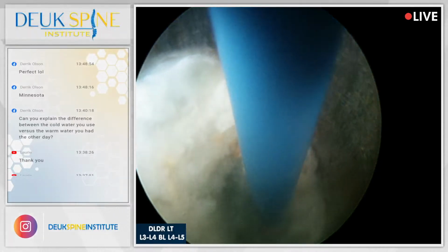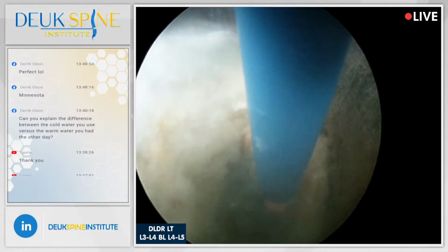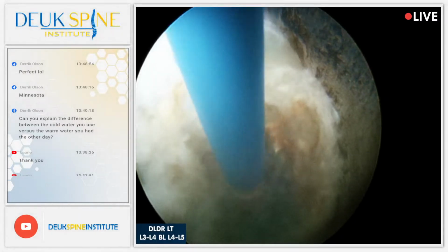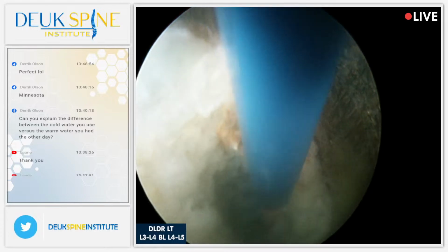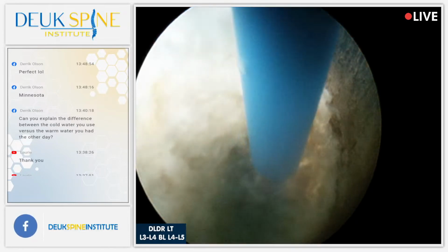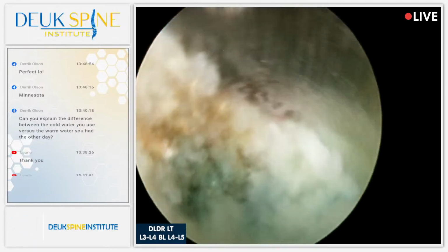You could probably, without any circulation at all, get up to a couple of 100 degrees. Well, we don't want that, because then you're cooking the tissues, and we're not interested in cooking the tissues. We're interested in breaking up the bonds, basically a process called vaporization. So we don't want heat energy, and the cold irrigation helps cool the tissues that are being lasered, basically.